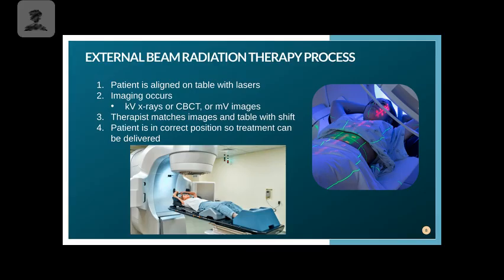However, I would say typically, out in practice with X-ray, we don't really worry too much about the SSD. We care more about the SID. So we're looking at the distance to the detector, not to the skin. But in radiation therapy, we're not trying to image to a detector. We're imaging to look at the patient and see how far am I from the patient's skin compared to my last time. So that way I'm not treating the wrong area. So it's just another safe measure to ensure that we are delivering the correct dose and to the correct location.